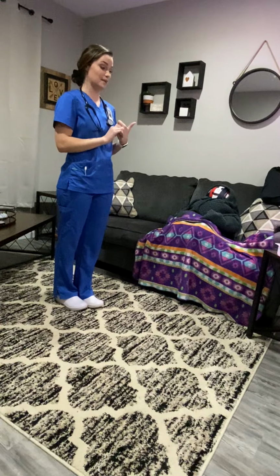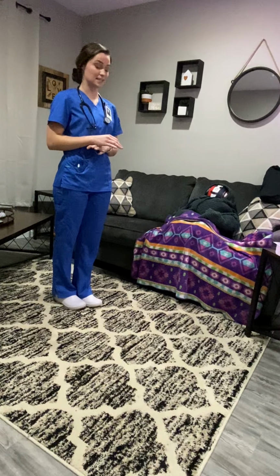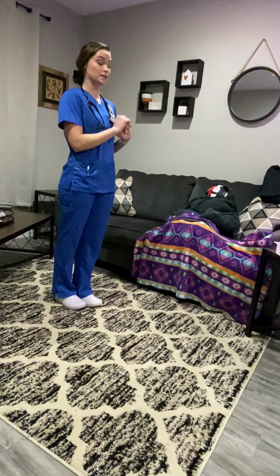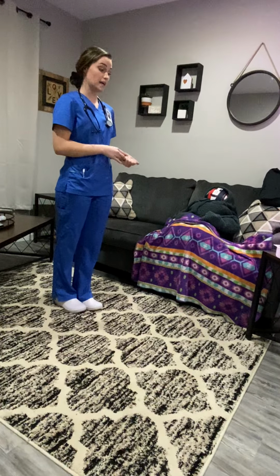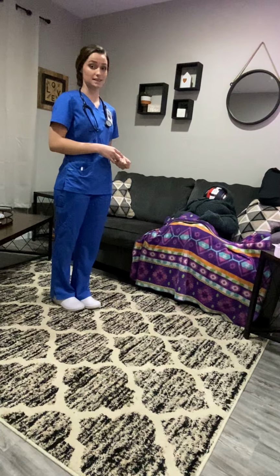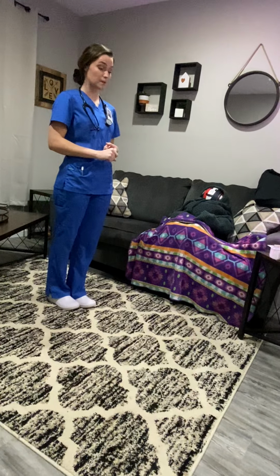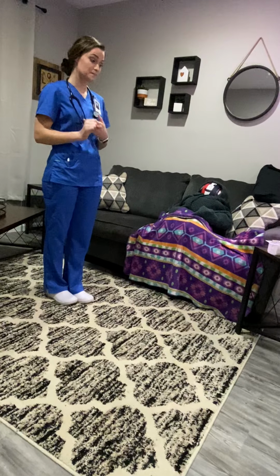I'm going to assess my patient's height and weight according to her body mass index, so the things that she needs for nutrition. I'm going to look at my physician's order and gather the appropriate nasogastric tube according to the size that the physician wants. I'll have suctioning equipment if that's what the patient is getting the NG tube for, or feedings if that's what she's getting it for.